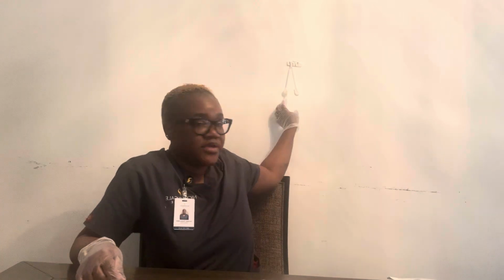And for this, I have my secondary set, and that is also macrodrip at 20 drops per ml. And I also have my alcohol prep pad, and I have my piggyback hangers here.